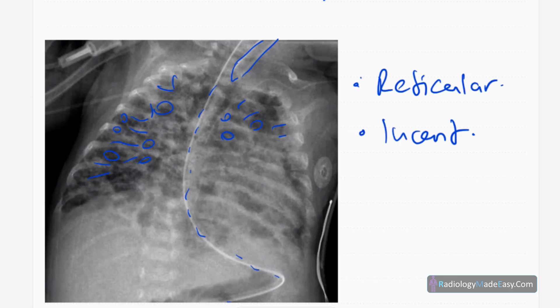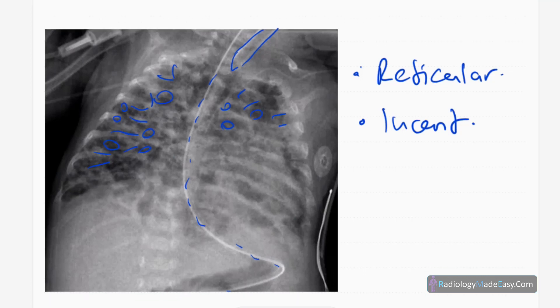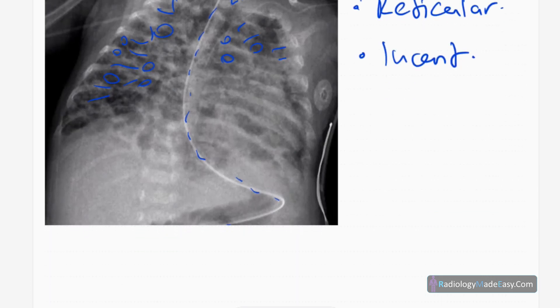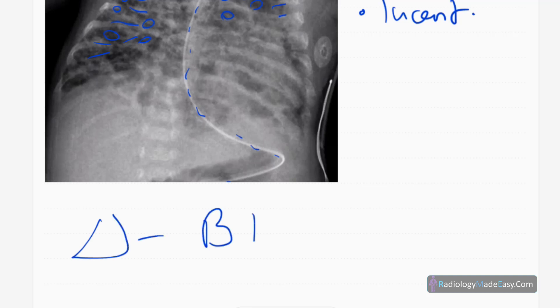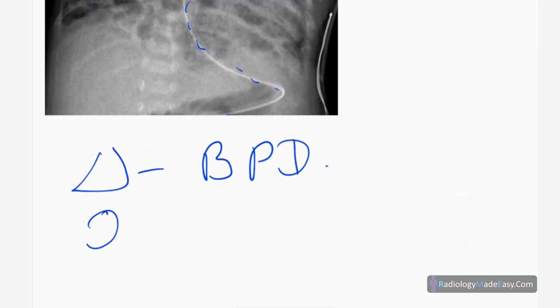There are no mediastinal masses, no pleural effusions, no pneumothorax, no bony abnormalities, and no vertebral abnormalities.